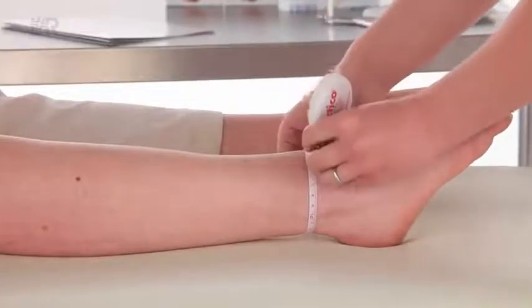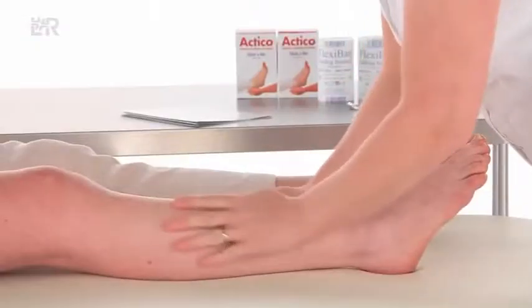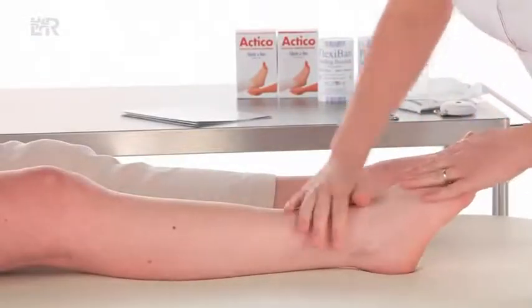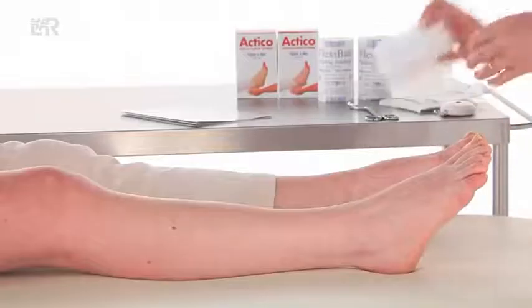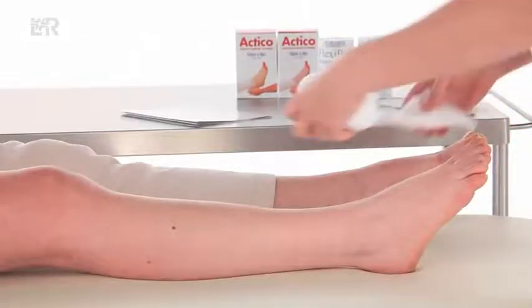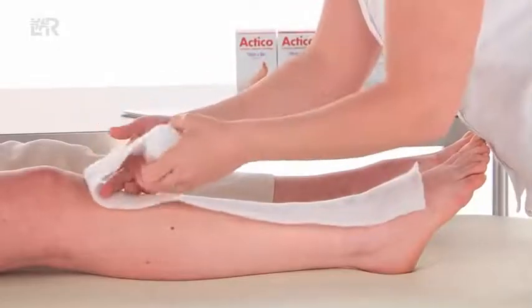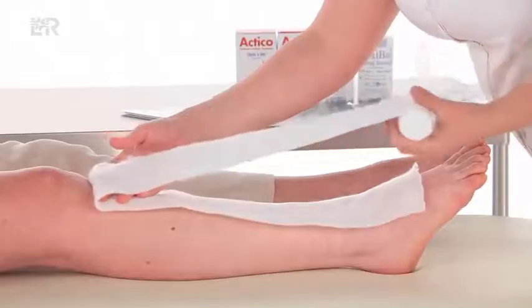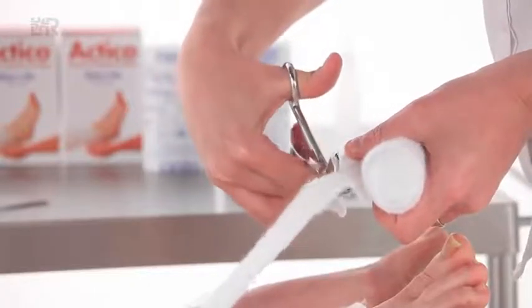Measure the ankle circumference before and after the padding layer is applied. Assess the shape of the limb, ensuring sufficient padding is used to protect vulnerable areas and, if necessary, reshape the leg to provide graduated compression. For ankle circumferences less than 18 centimetres, apply enough flexiband padding to bring the ankle measurement between 18 and 25 centimetres.